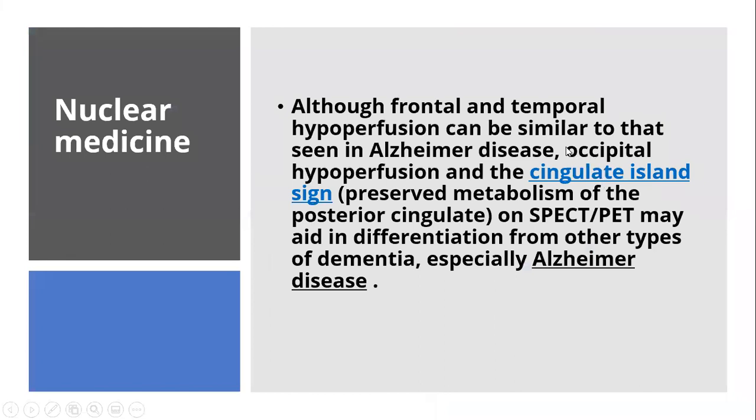Nuclear medicine. Although frontal and temporal hypoperfusion can be similar to that seen in Alzheimer's disease, occipital hypoperfusion and the cingulate island sign, which means preserved metabolism of the posterior cingulate on SPECT and PET, may aid in differentiation from other types of dementia, especially Alzheimer's disease.